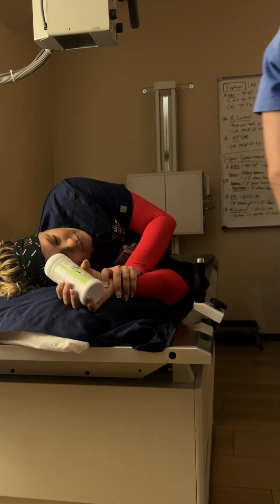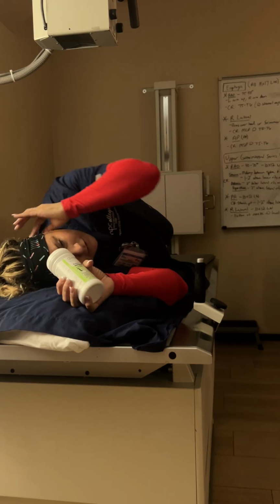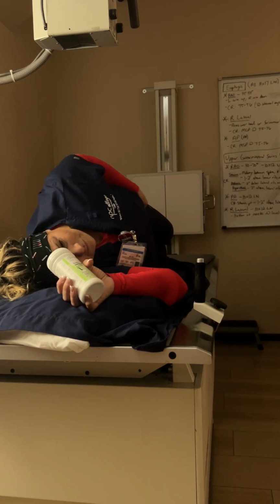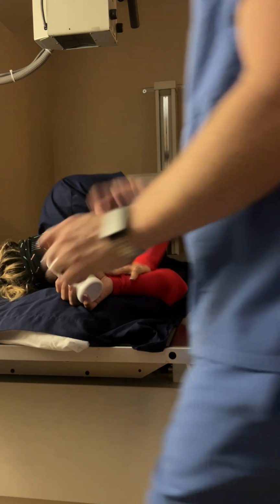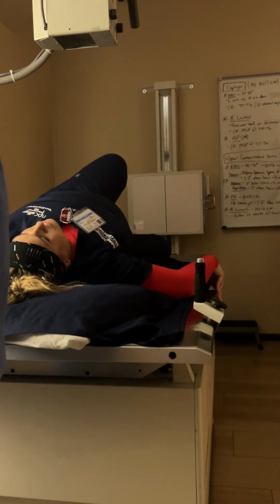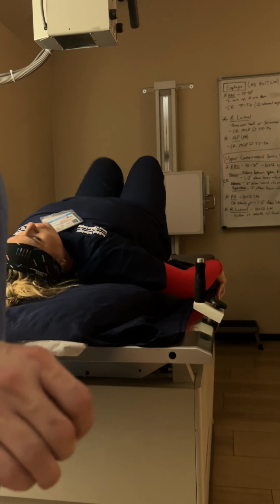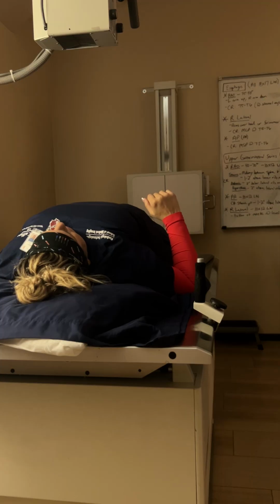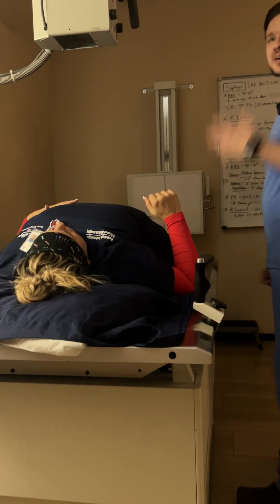Okay, right lateral, centered at about the level of T5 to T6. And then finally, lay on your back for me, okay? And why do we have to do, oh, that's in the position ordered that way, just out of curiosity? So we start with the RAO because, why do we start with the RAO?